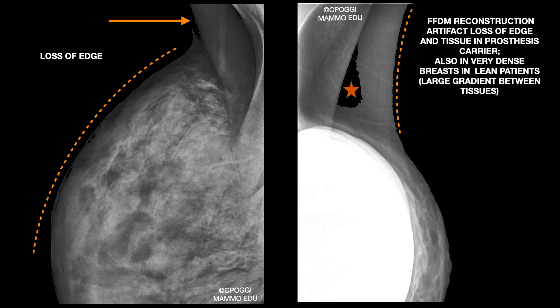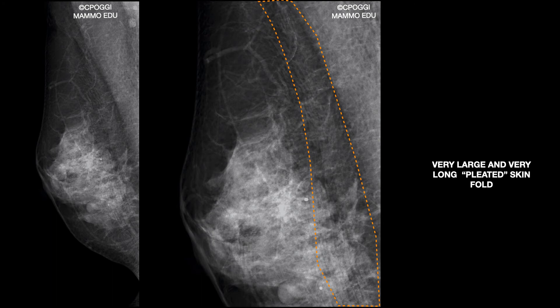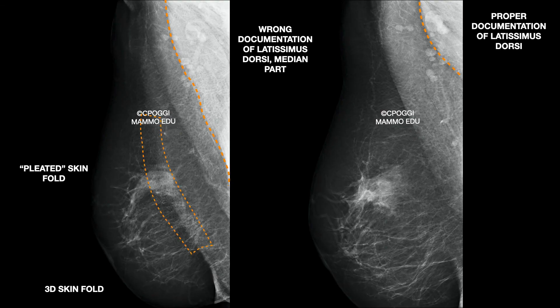It is a reconstruction artifact correlated to the dose delivered. Here is a very long pleated skin fold — here magnified — due to improper stretching of deep lateral tissues; the compression itself leads to a kind of accordion effect. Same problem, less important, with a huge 3D fold, both of them due to the wrong inclusion of the central part of latissimus dorsi. Alongside the repeated projection with the correct portion of latissimus, there is still a fold, but much smaller.